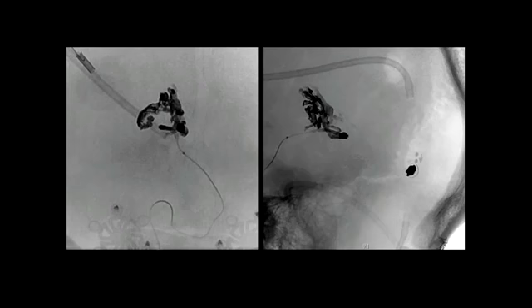The embolization can be continued over half an hour to sometimes as much as an hour to allow percolation of the correct fistula pocket. And you can see in these images that the Onyx is now getting into the accessory pockets associated with the fistula. This start-stop technique is used to allow the Onyx to polymerize and then to find new pockets.